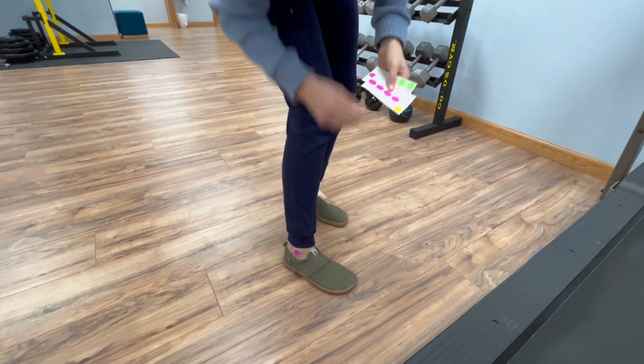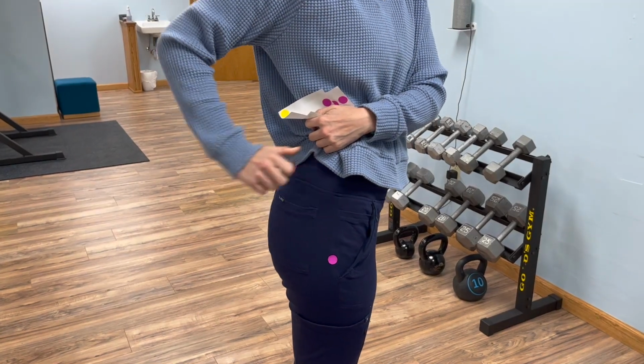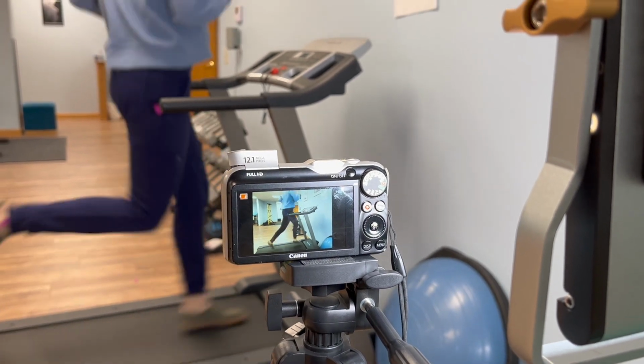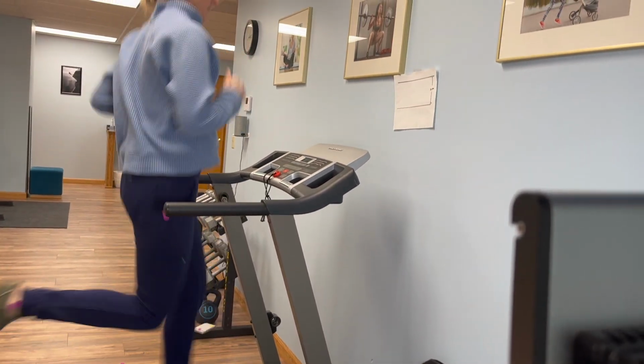How do we analyze? First, we'll start by placing bright stickers on the bony structures to help mark off different parts of your pelvis, your spine, and your feet. We'll perform slow motion video recording and input the videos to a software to analyze joint angles, foot placement, hip drop, arm swing, and other key factors in your running form. The therapist will then be able to assess some of the findings in real time while we're watching you run.